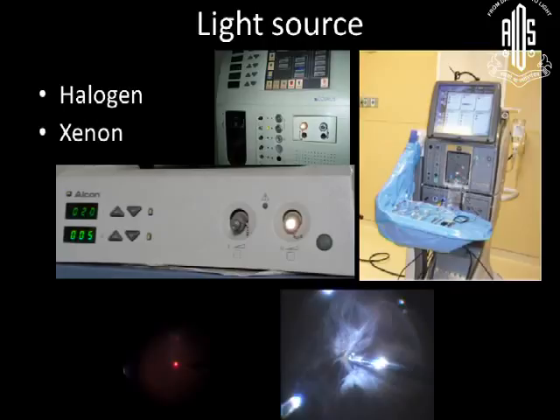In vitreoretinal surgery, like Gaurav mentioned, we used to have halogen light. But once we moved away from the Landers lens system to wide-angle systems, well, with halogen light, this was the kind of view we used to get. The older generation machines would come with a halogen light source or a metal halide light source, and then we moved on to extra attachments and got a xenon light source. But current machines have an inbuilt xenon light source, so you don't really have to worry about the quality of pictures.